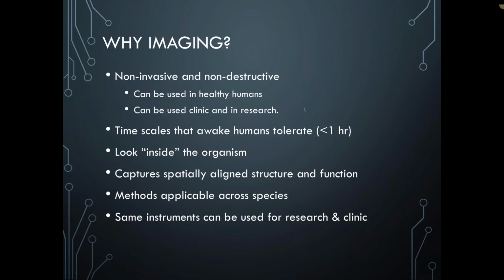We can also apply these methods across species, and in particular, we can work with mice and other rodents to develop the methods that then can translate into humans. And these same instruments can be used in the clinic, but also then in research.